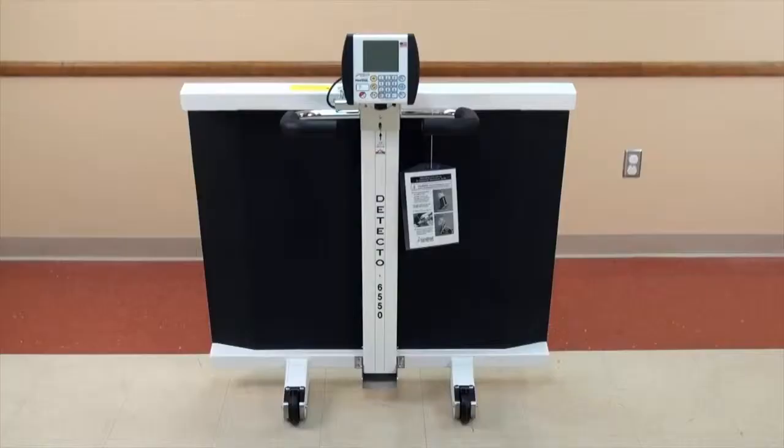The scale should always be stored in a secured, upright position, preferably near a wall for maximum safety and protection against damage.